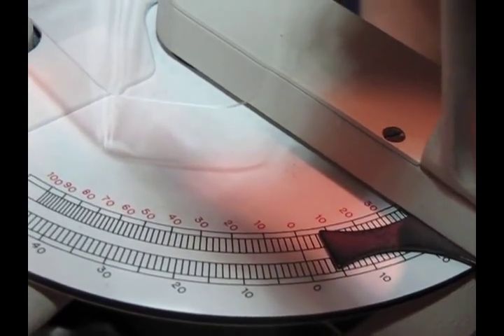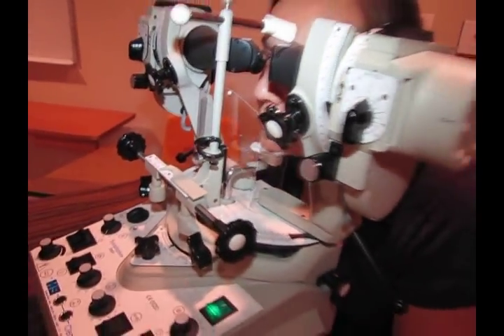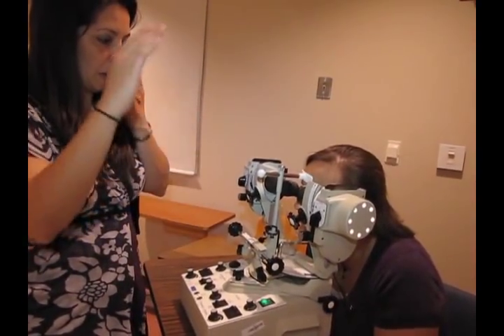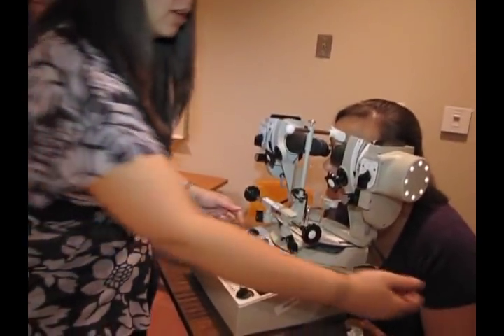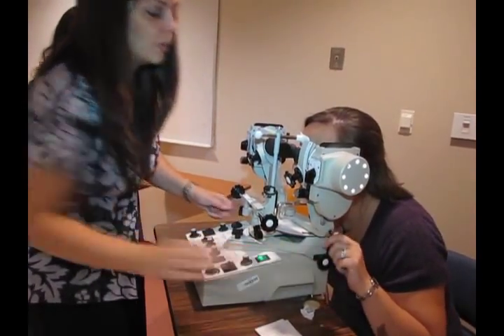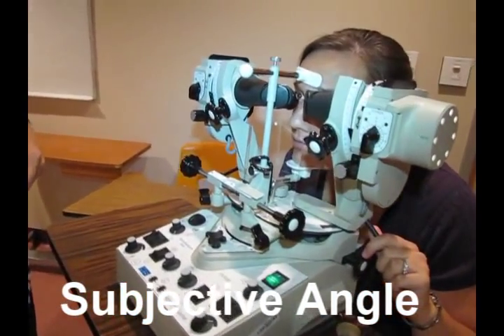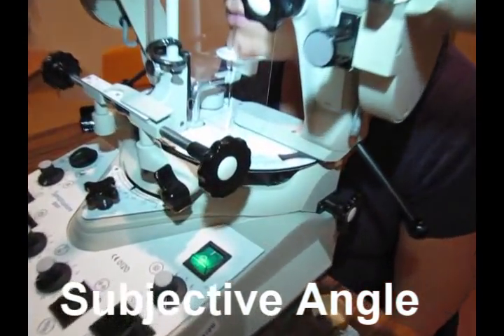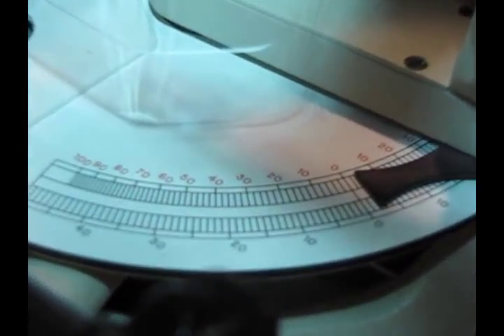So now I'm going to ask her, tell me if you see the lion in the cage at the same time. Yes. Then you want to find out, is the lion inside the cage equally side to side? No. And what about up and down? Yes. Okay, so now I'm going to lock one of these. And basically I want to grab your hand over here. And you're going to allow her to move it to where she sees the lion in the cage equally. No. So now if we look, remember each line represents 2, so now we're getting 4 base in.